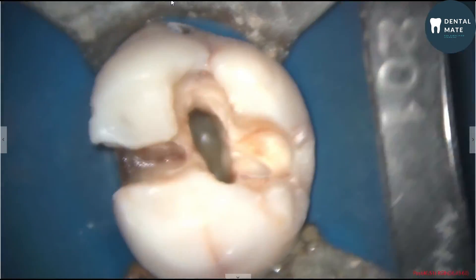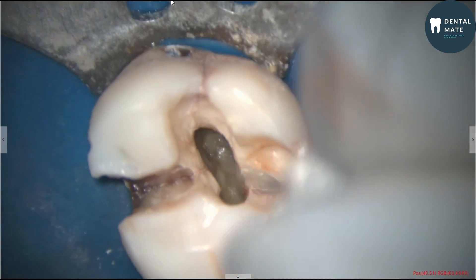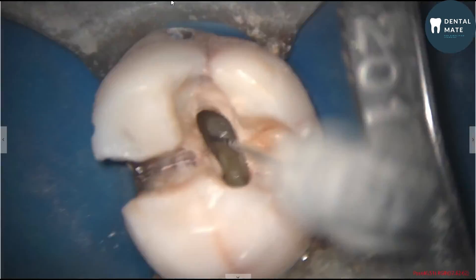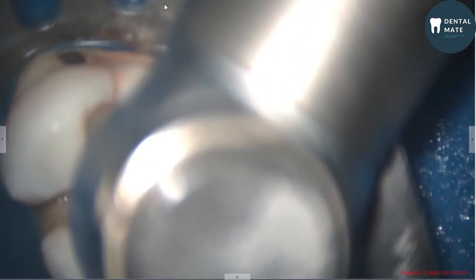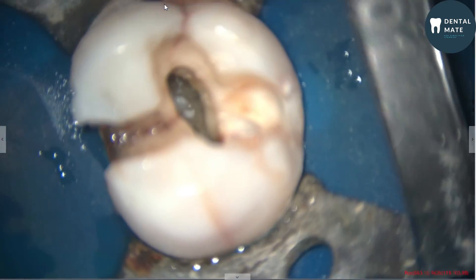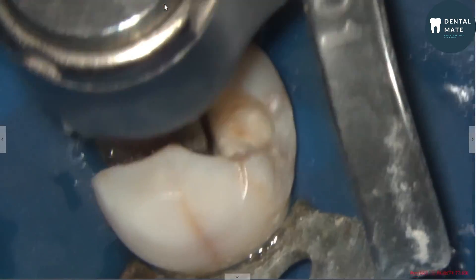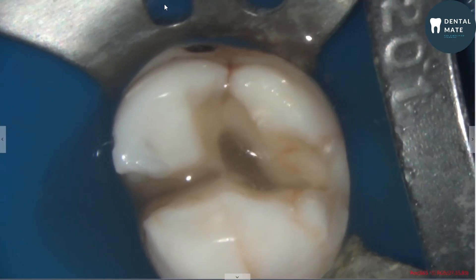Now we're looking for the MB2 canal. We look on the developmental line connecting the mesiobuccal and the palatal canal. At the developmental line connecting MB1 and the palatal canal, I have located the MB2 canal. I am slightly de-roofing the mesiobuccal canal further to have straight-line access. When the MB2 canal is located, the triangular shape of the access cavity is converted to a rhomboidal shape for the maxillary molar.